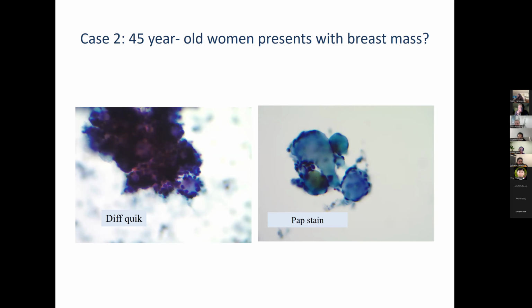So with this, what would your diagnosis be? Is this benign, malignant, or do you think of any particular specific entity? That looks more like benign to me because they're well arranged. They are together. I cannot see exactly the nuclei, but that's my gut feeling.